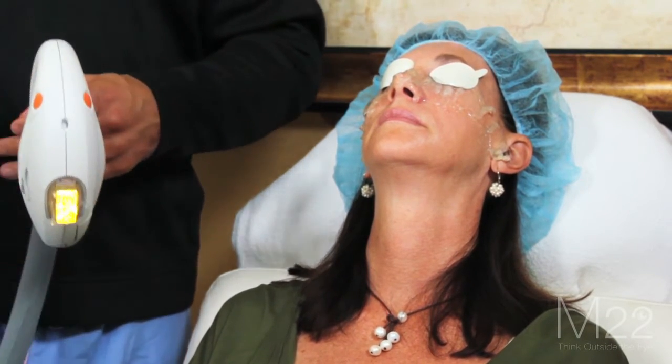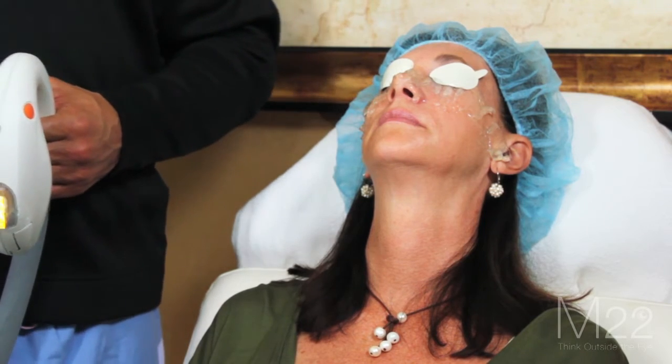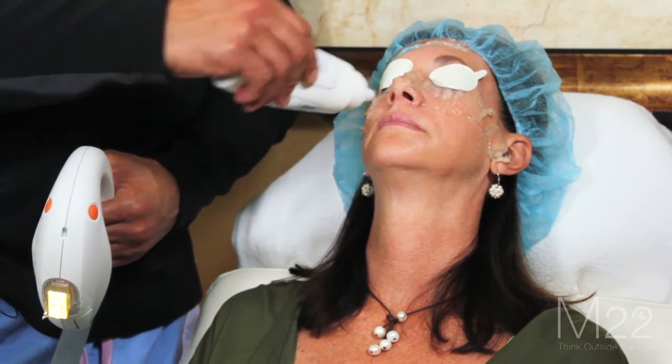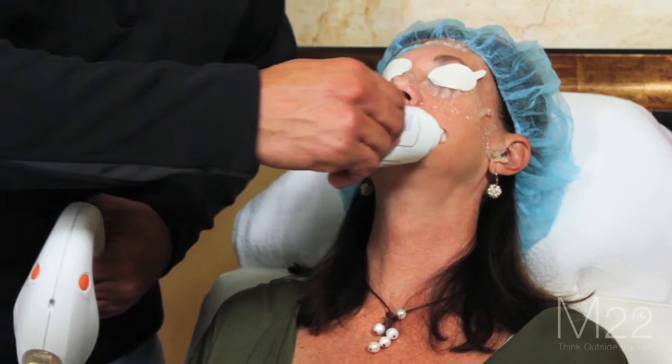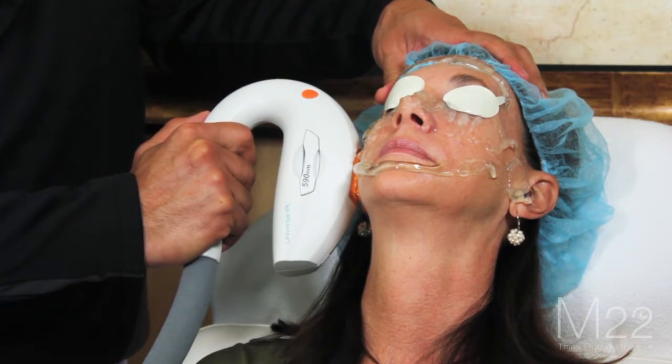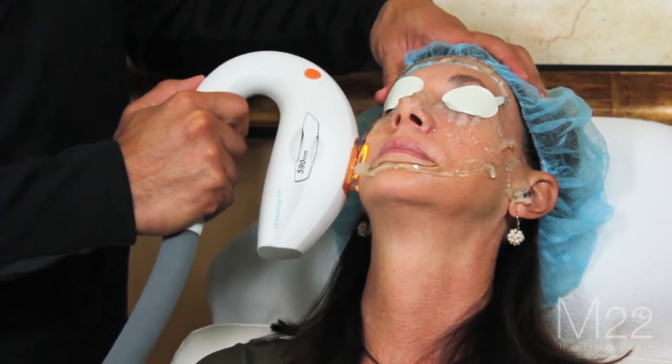If somebody wants a full facial IPL treatment, we're going to do one pass in the parts we didn't get. I did 13 joules per centimeter squared on this patient. What I'm going to do is increase to 15 joules and do a one pass on the places where I didn't treat.